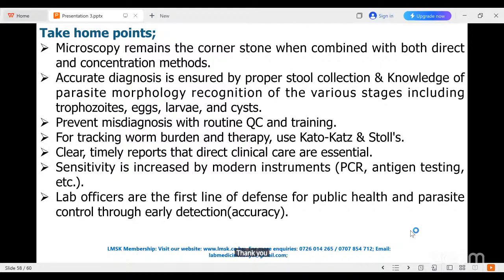Thank you. Next, Just per Olum asks, our normal bench microscopes do not show distinct bodies like the flagella and the rest of the identities. Is there any difference in motility between G. lamblia and the other parasites?